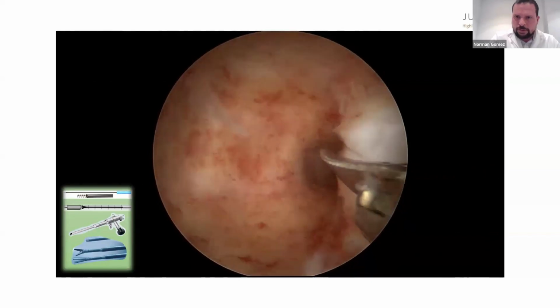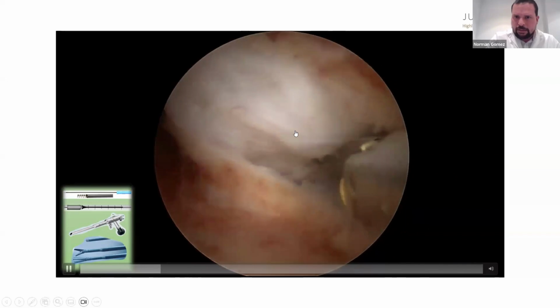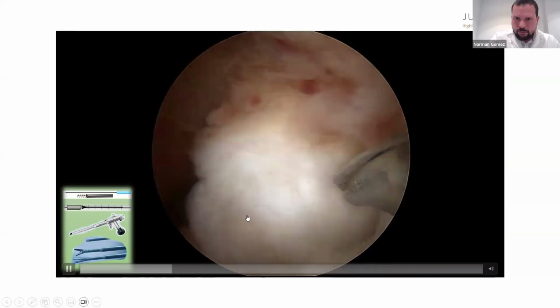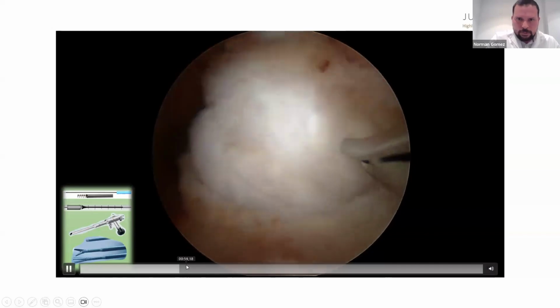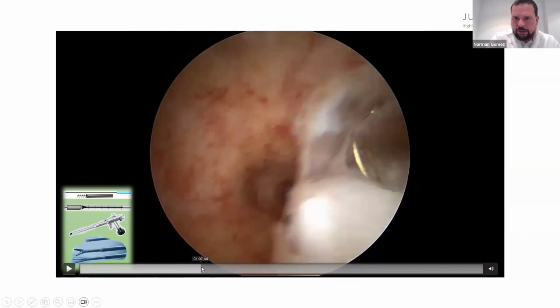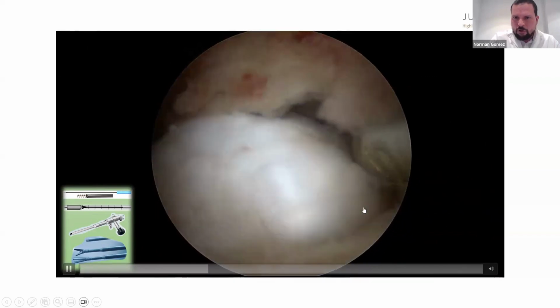We open the jaws of the scissors in the correct plane, and we can dive inside the pseudocapsular plane. When we cut a lot of surrounding tissue of the fibroid, the attachment is almost free.